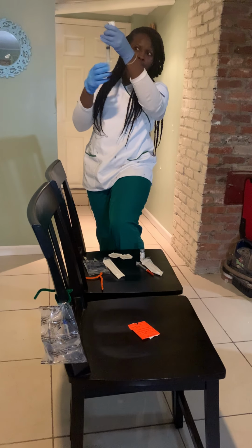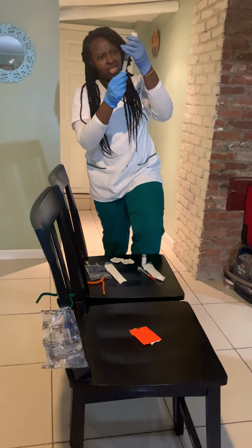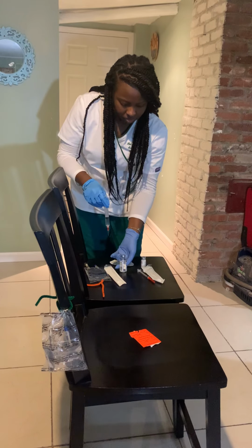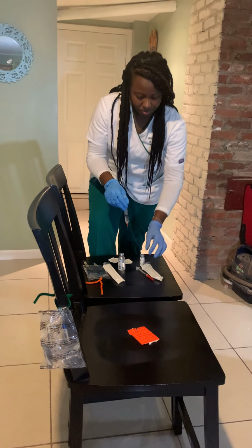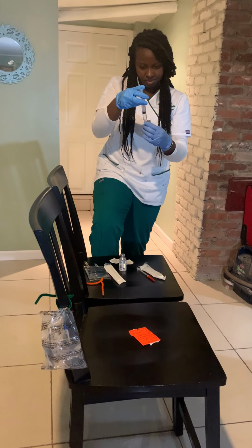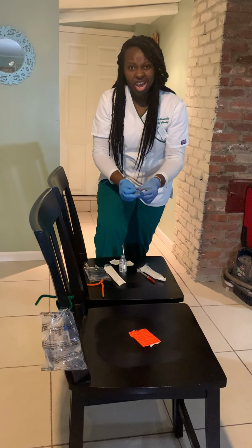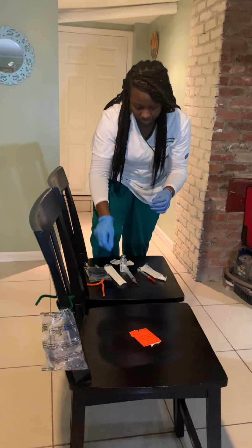Just making sure it's the correct amount in the syringe, and that's going to be 5.6 ml of fluid. I'm going to put it into my vancomycin, which I've already cleaned. Now I'm going to recap this and then put it into the sharps bin for safety.